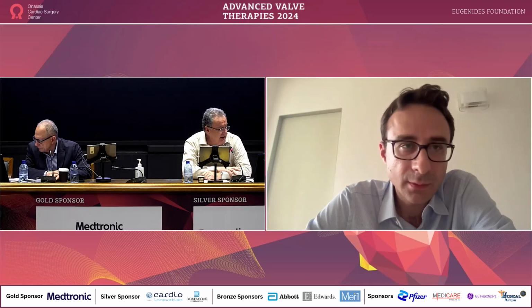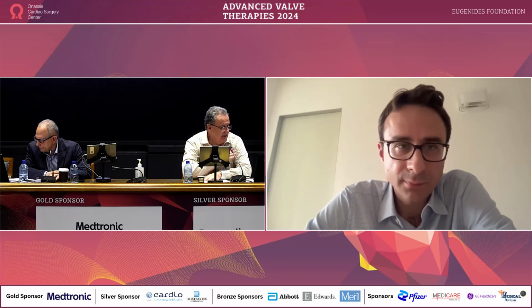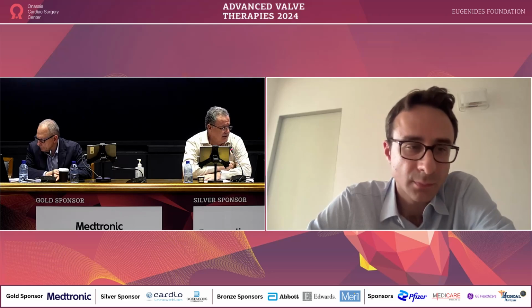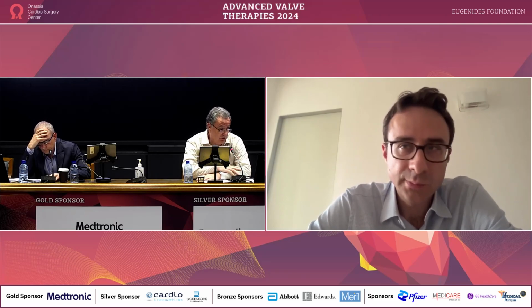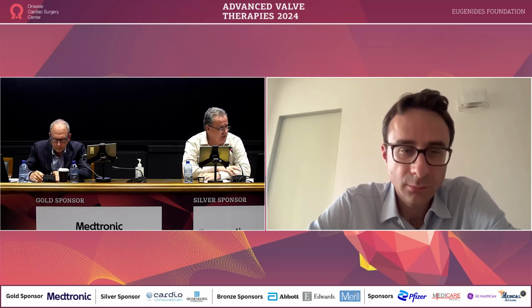Thank you so much for your clear presentation. It is quite clear that this is a delicate operation, and of course very good preparation is necessary, as you said, with very close cooperation between the echocardiographer and the invasive operator, and the whole team has to know every detail of the operation and the anatomy of the structure.